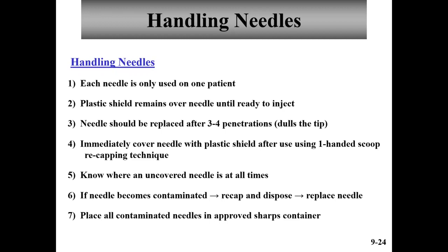You always want to recap the needle, the plastic shield or cap. You want to use only one hand when you recap, and I'm going to make you use your non-dominant hand. For most of you, it will be your left hand. But you take your non-dominant hand and put it behind your back and learn how to recap your needle with your non-dominant hand behind your back so that you learn how to recap only using one hand.